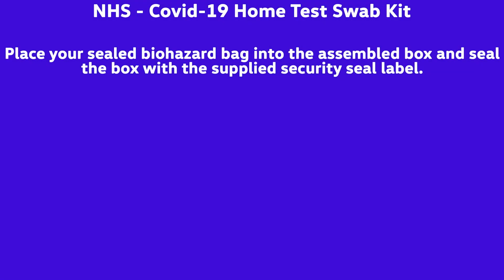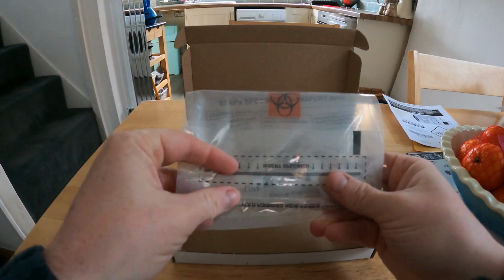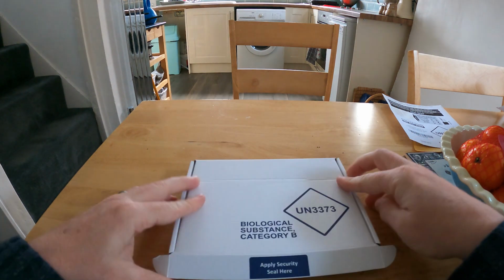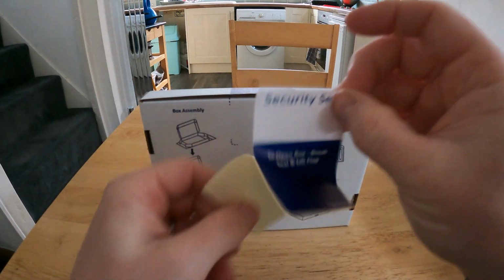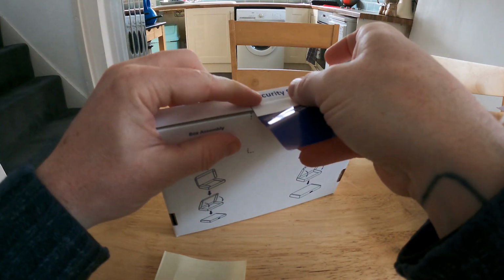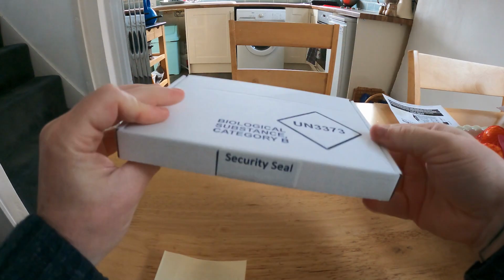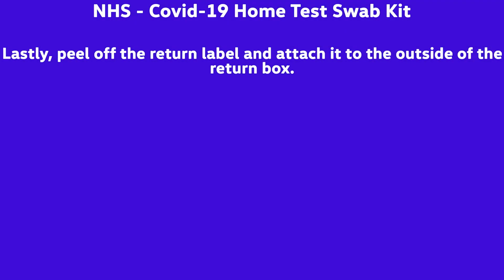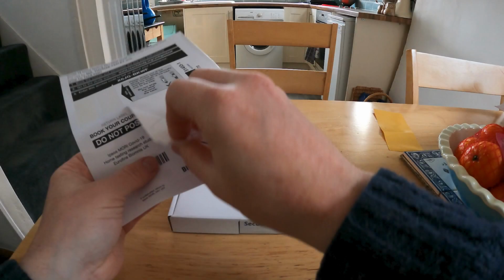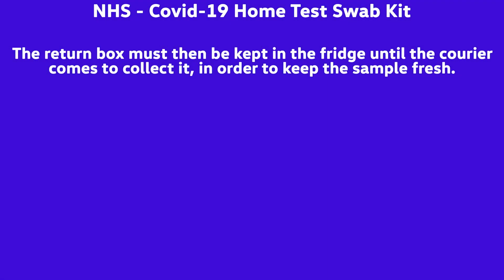Put your sealed biohazard bag into the assembled box and seal the box with the supplied security seal label. Lastly, peel off the return label and attach to the outside of the return box. The box must then be kept in the fridge until the courier comes to collect it.